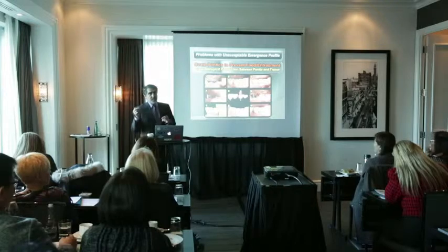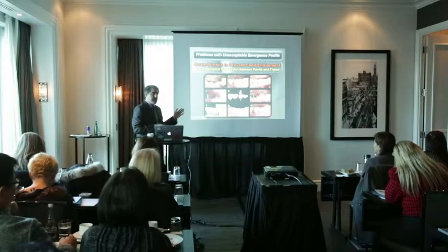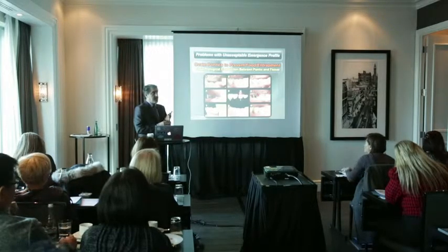In RPD cases, we need to develop the right guiding plane. In these cases, we need to develop the right contact. So, recontouring of the adjacent teeth.